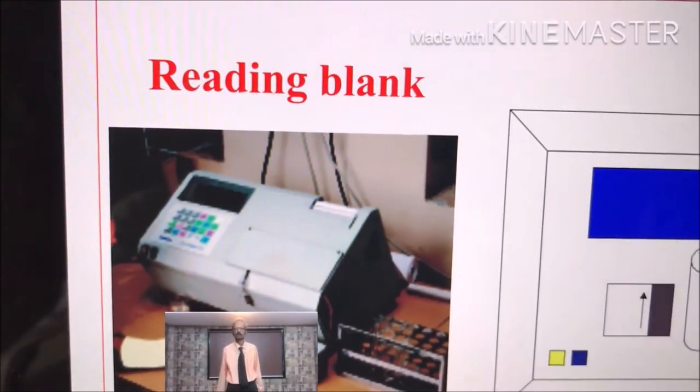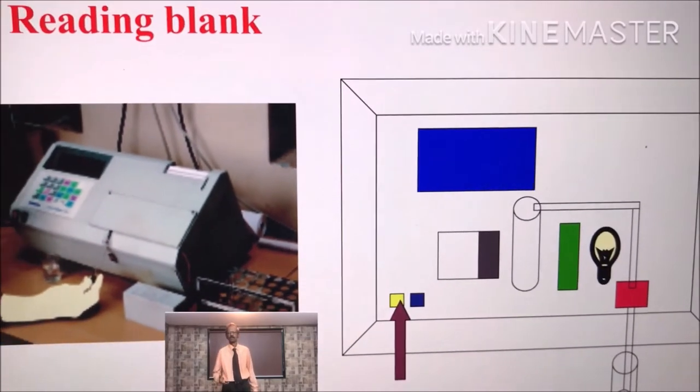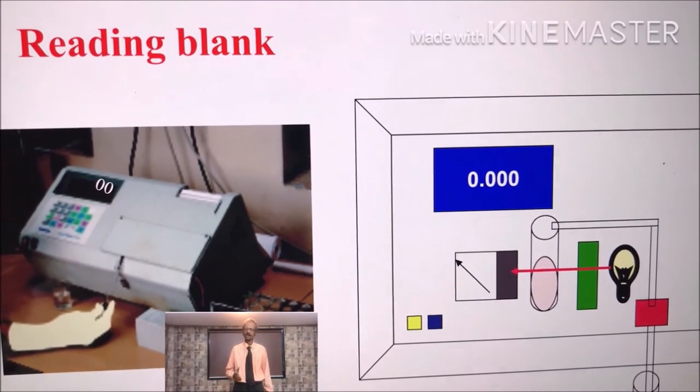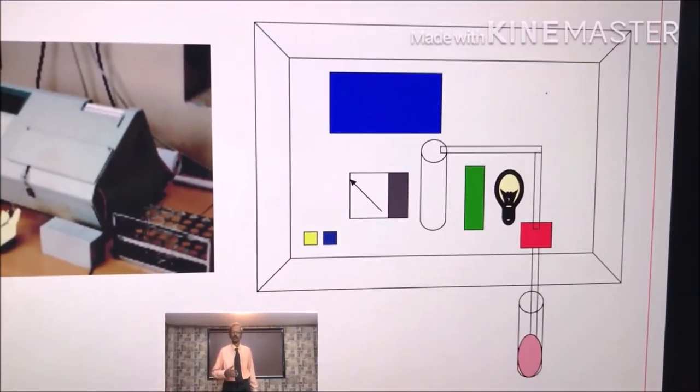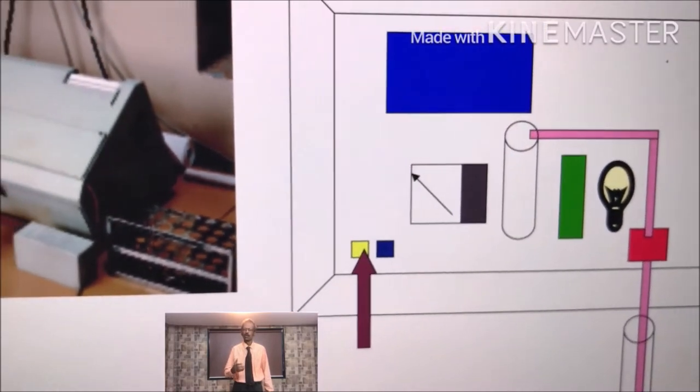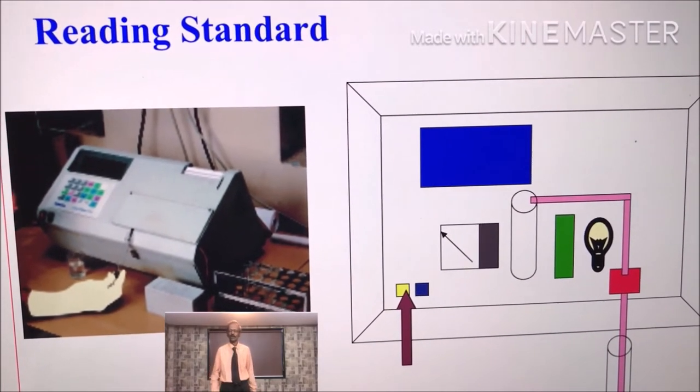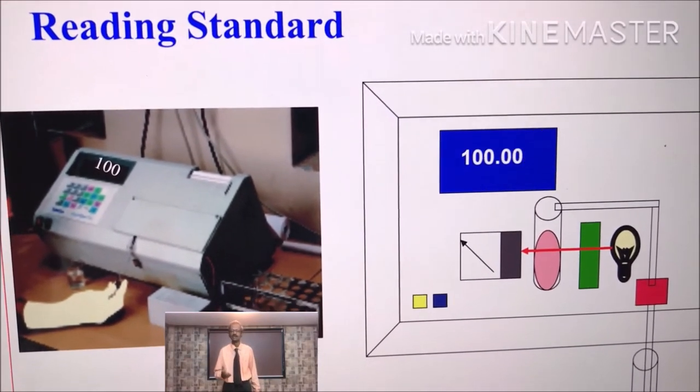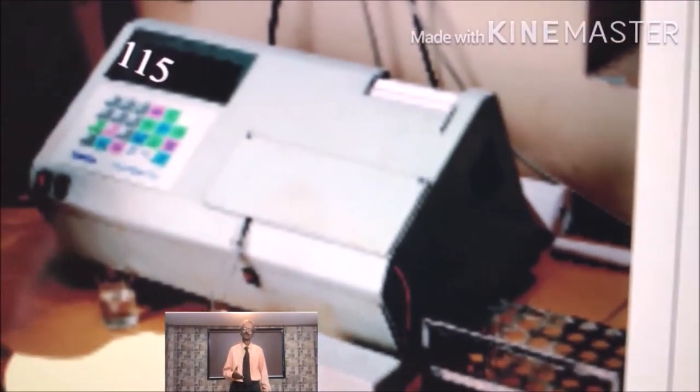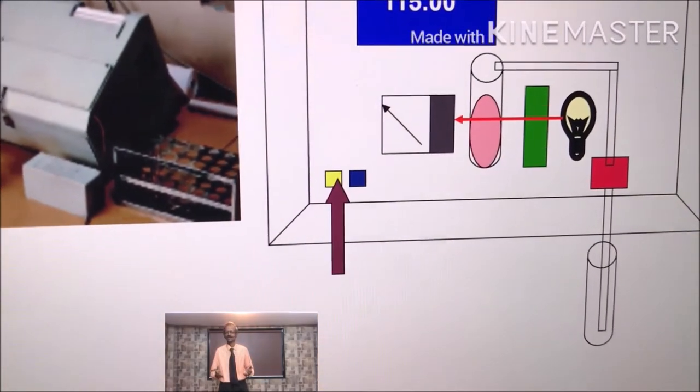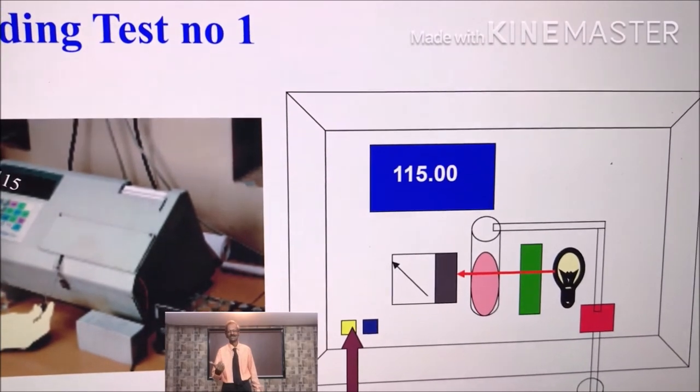For reading blank tube, hit this button. Introduce the blank and read. Now introduce standard this way and again hit this button. Just see how standard is introduced inside the thermocuvette of the analyser and recorded 100 milligrams percent. Now take reading of test one. Introduce the contents of test one to analyser by hitting this particular button and you get 150.